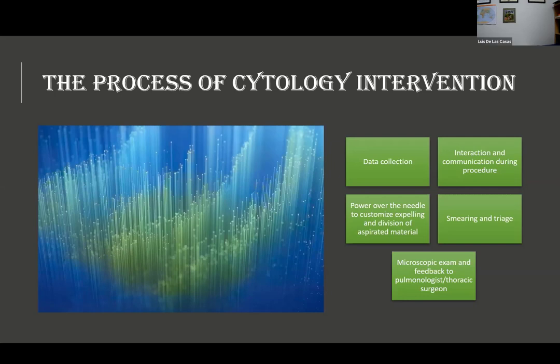And on occasions, suggest some specific actions, as we are going to discuss later. Control of the needle is also very important to obtain small drops for smearing, division and triage of the material as desired, and appropriate smearing technique. Pause the procedure when needed. For example, after two or three passes, if they continue doing passes, you don't have time to focus or concentrate or do certain things that require time.